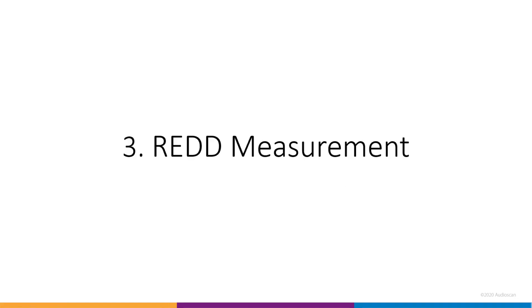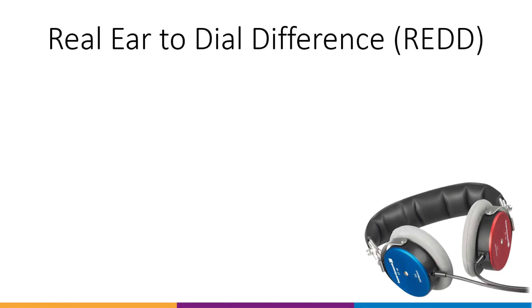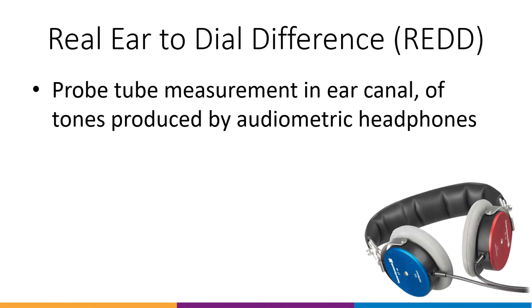Three, Real Ear to Dial Difference Measurement. The Real Ear to Dial Difference Measurement, or REDD, represents the difference in decibels between the SPL measured by the probe tube microphone and the audiometer dial setting that produced it. It's specific to the client, headphone, and audiometer used to generate it.